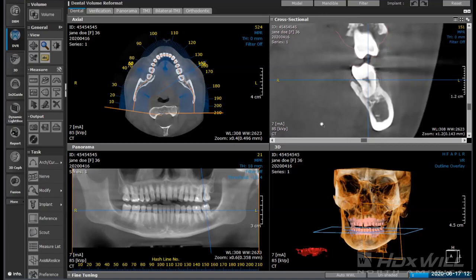So usually in terms of STL accuracy, an intraoral scanner is superior, but next to it would be the stone model. The reason is that the stone model has already been impressed, it's not going to expand or contract, and it's going to be sitting there on a model stand. And we actually have model stands that we can use to scan with our CBCT.